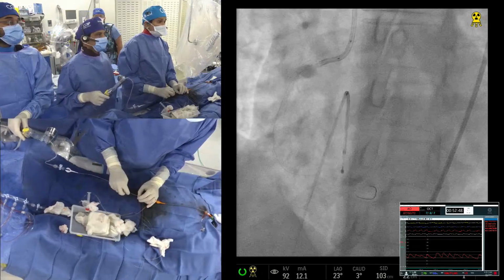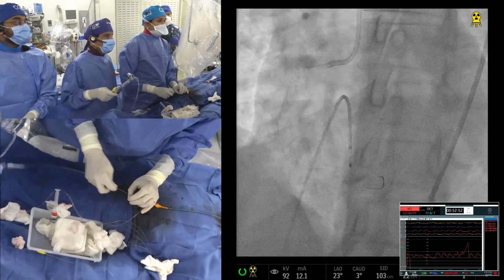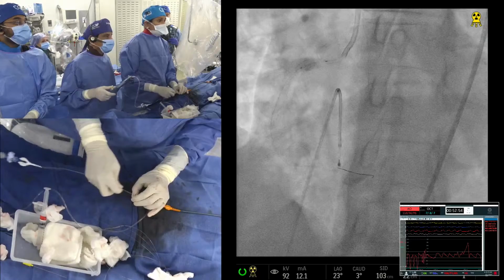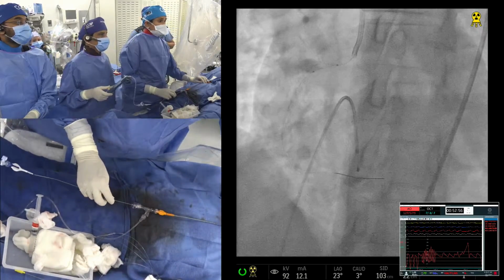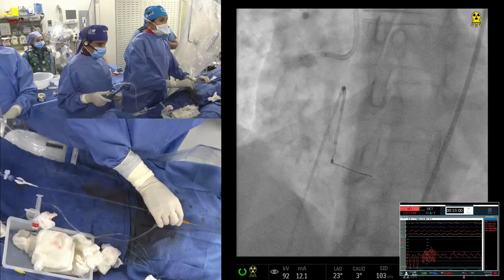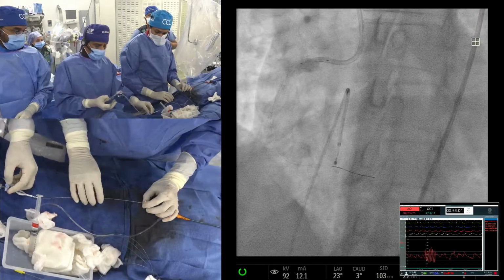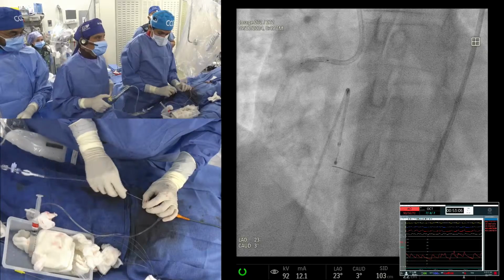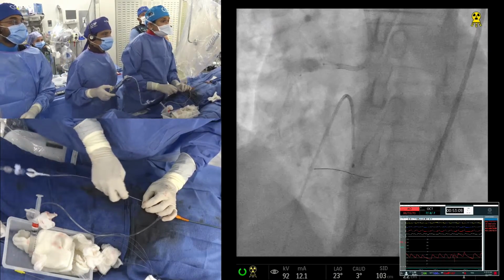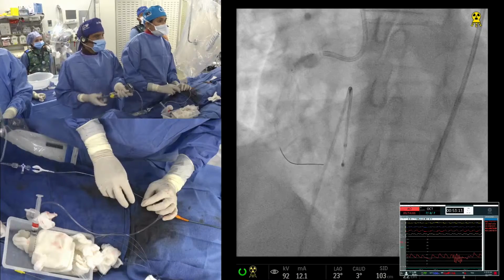And if there is no good distal flow, overlapping, I want to go a little further. You should not even do the OCT. There's a risk of VFib. Just 1 second. Let me go more negative. Good. Good. That's it. That's all we need. Okay, ready for the OCT?